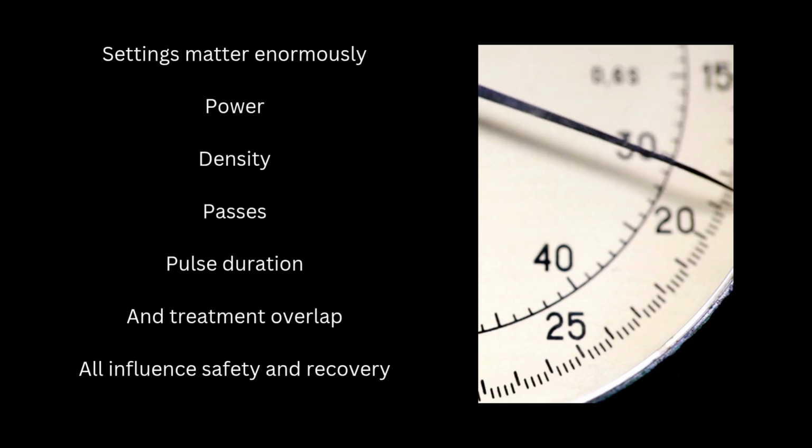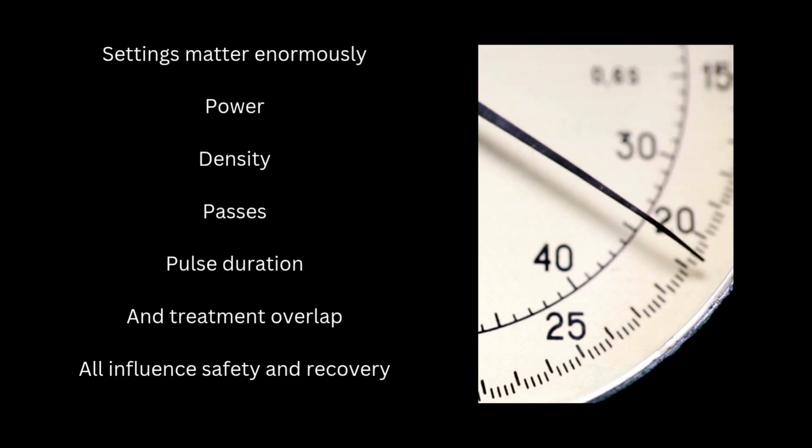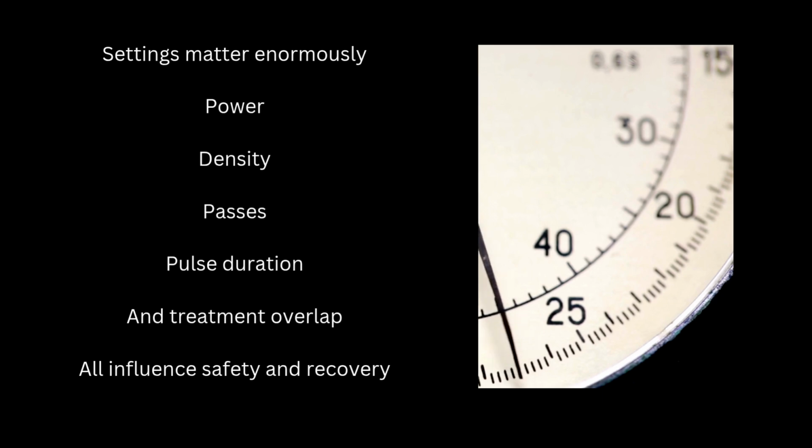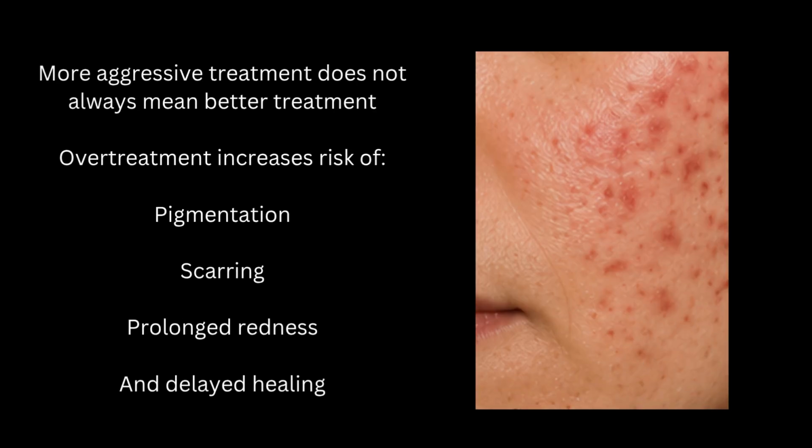Settings matter enormously. Power, density, passes, pulse duration, and treatment overlap all influence safety and recovery. More aggressive treatment does not always mean better treatment. Overtreatment increases risk of pigmentation, scarring, prolonged redness, and delayed healing.